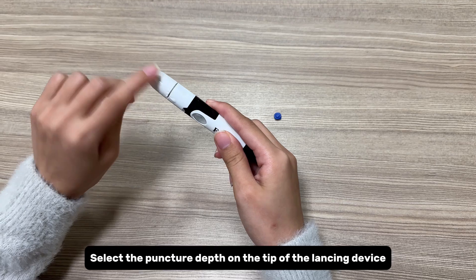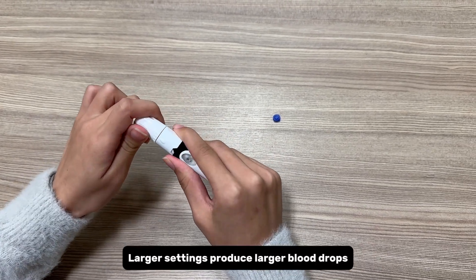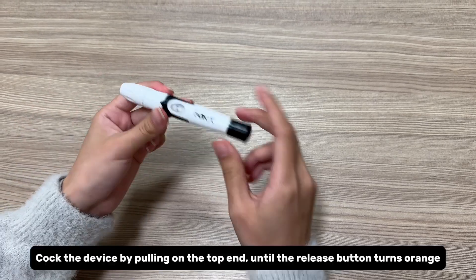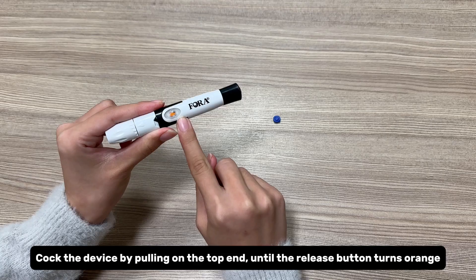Select the puncture depth on the tip of the lancing device. Larger settings produce larger blood drops. Cock the device by pulling on the top end until the release button turns orange.